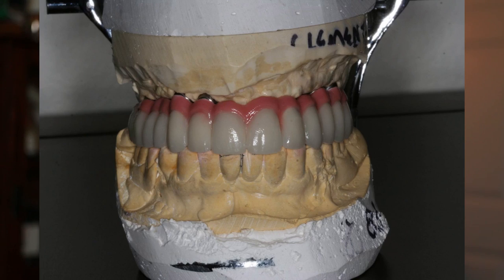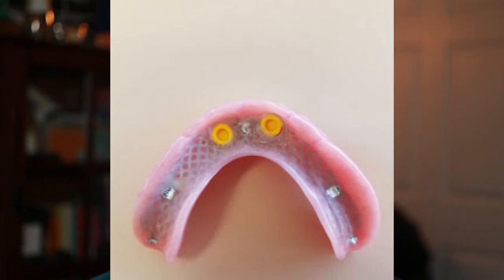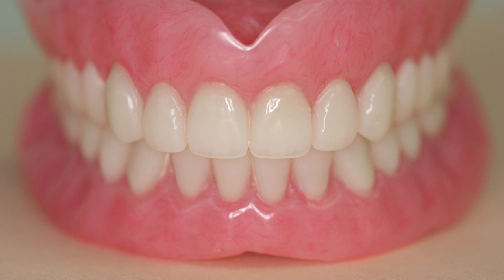This patient's teeth were failing due to a combination of periodontal disease and cavities, and he needed to do something about it. His options were either non-removable teeth on implants, commonly called all-on-four even though sometimes more than four implants are used, removable teeth on implants commonly called implant overdentures or snap-in dentures, or regular dentures with no implants. He decided to go with implant overdentures.